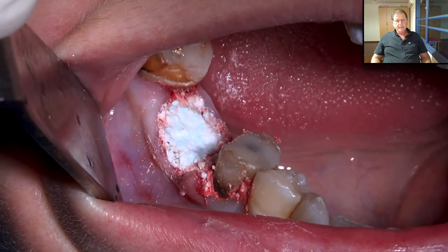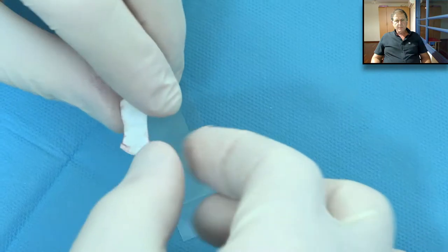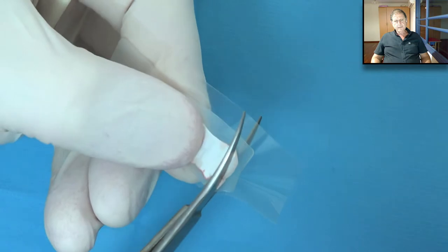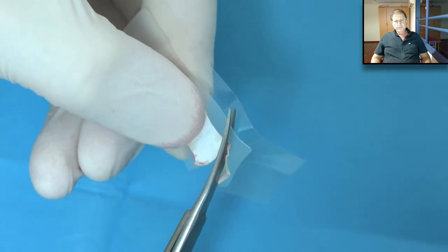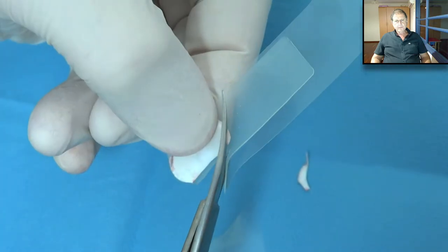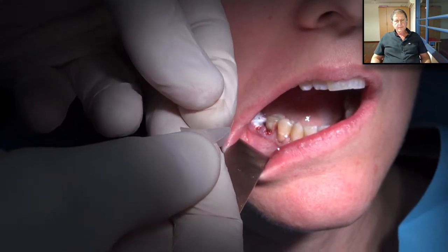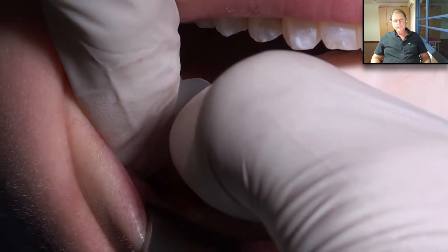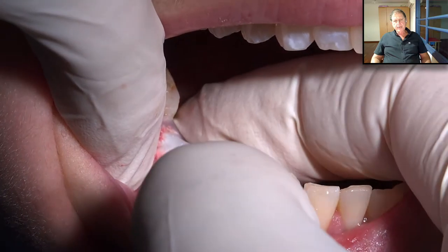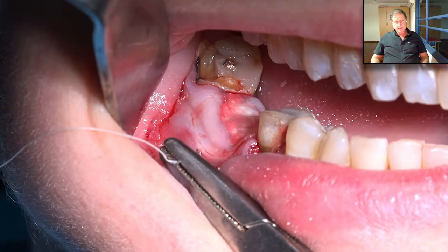Now we remove the excess. Before placing the Oraid, we clean the area with a dry gauze and then with a moistened gauze. Now we cut the Oraid accordingly, detach it from the liner, place it on the gum, and press. It sticks immediately — that's just fantastic.